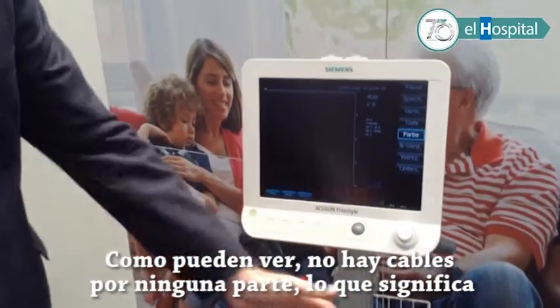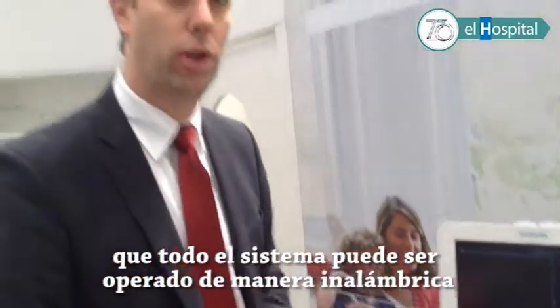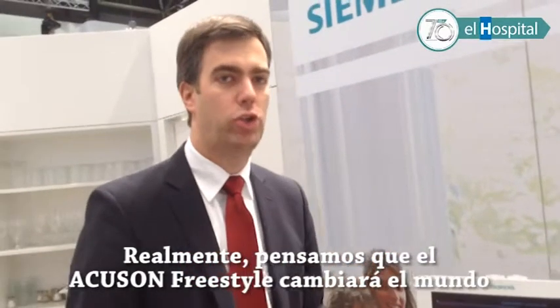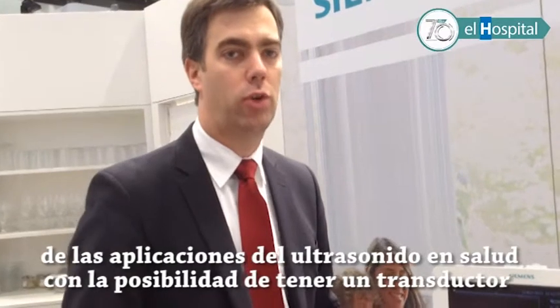As you can also see here, there is no cable plugged in. The whole system can also be operated on battery for roughly one hour. We really think that with the ACUSON Freestyle, we have changed the world of point-of-care applications and ultrasound for needle guidance.